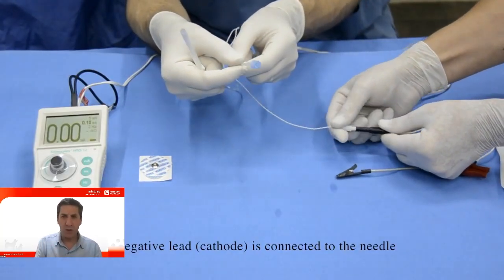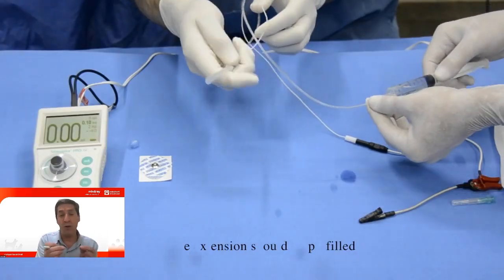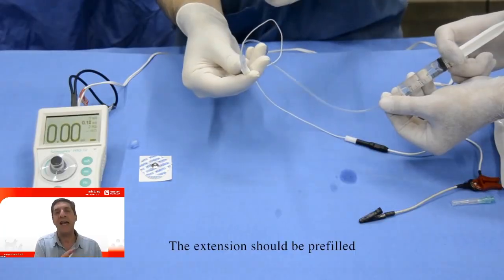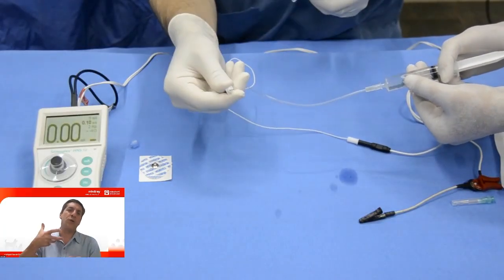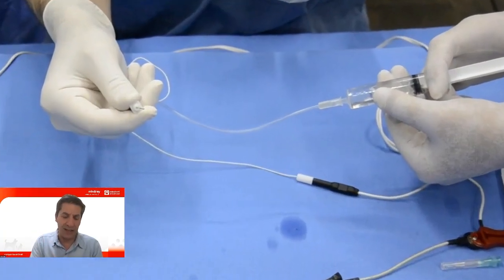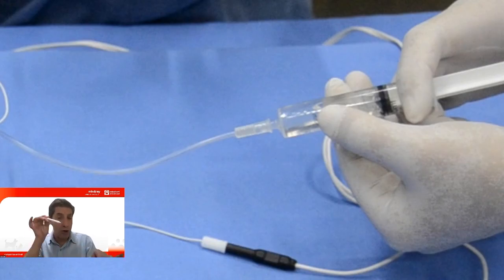Okay? So as you can see, we have two electrodes. The needle has a cable which sends the electricity and has an extension line that we use to make the injection of the volume. This extension line is very important and useful during the practice of regional block because as soon as you reach the place, the needle should be still, immobile.